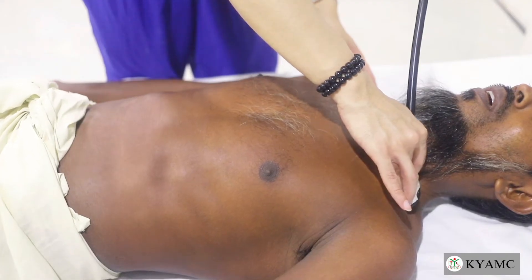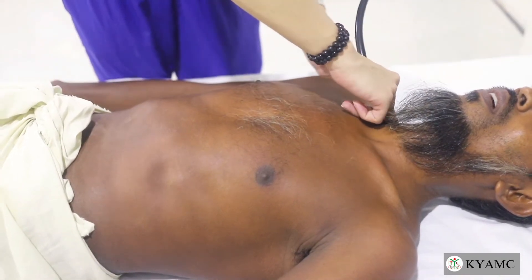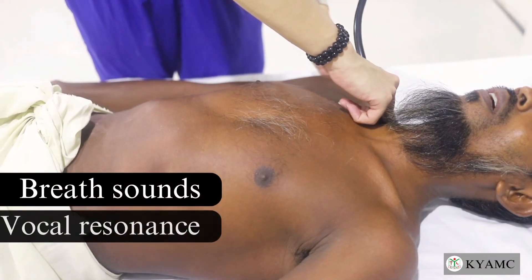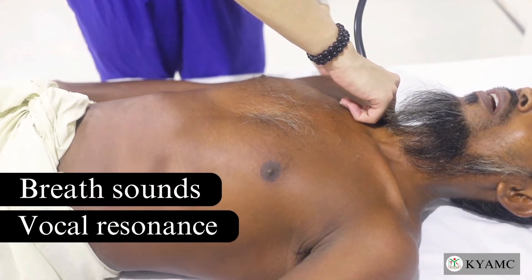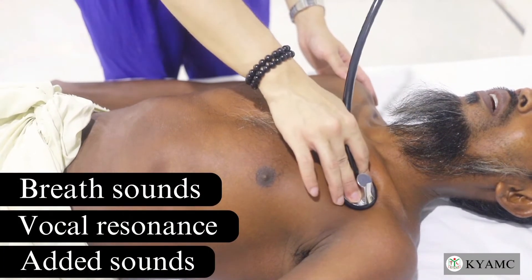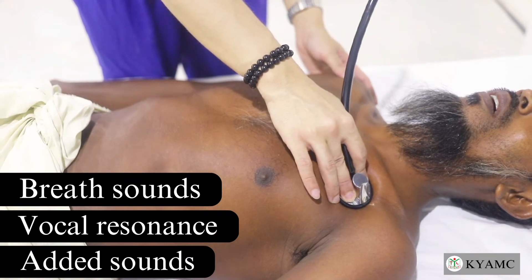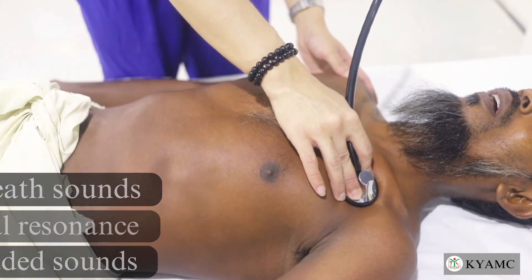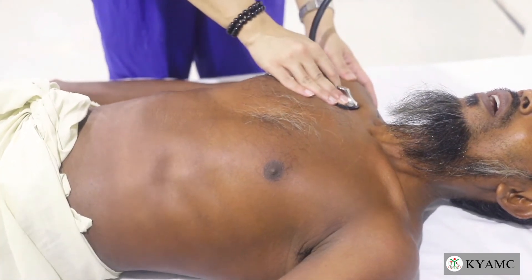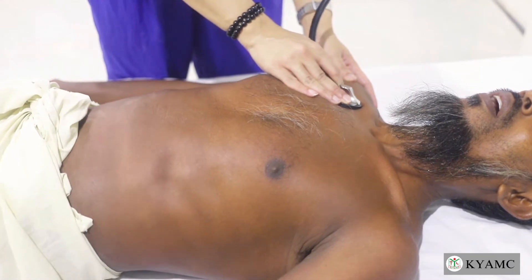Auscultation involves a thorough assessment of the breath sounds, vocal resonance, and any added sounds. Instruct the patient to take slow deep breaths in and out through their open mouths.